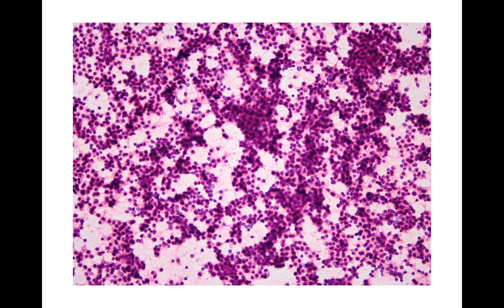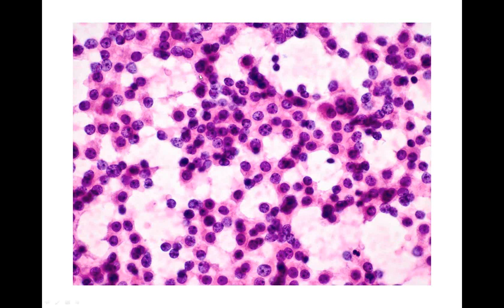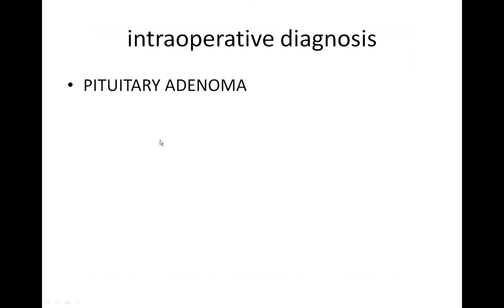Now, again, that might look scary, but just like in that meningioma, if we look very, very carefully, we see that the tumor cells themselves are very monotonous. They're very bland. They're not really wild-looking. There's no mitoses. There's no necrosis. There's nothing else that looks scary going on. It's just a bland pituitary adenoma. And so that was the intraoperative diagnosis.